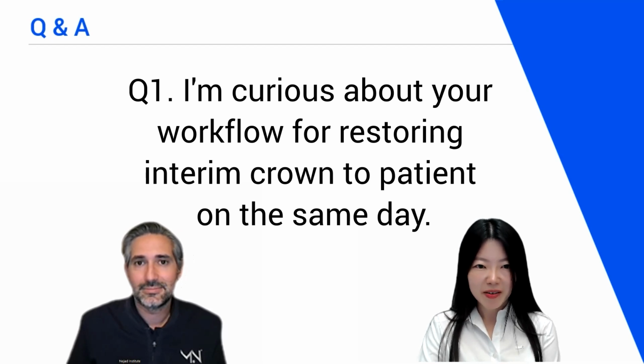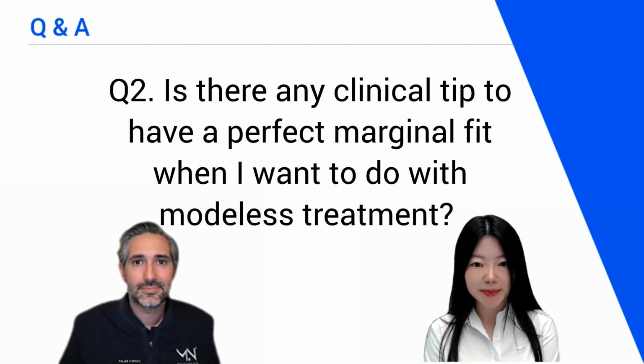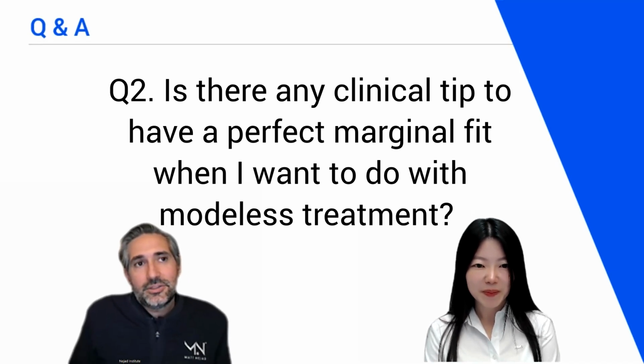Okay, thank you. Question number 2. Is there any clinical tip to have a perfect marginal fit when I want to do model-less treatment? A perfect marginal fit when you're doing model-less treatment. That's a good question. So I assume we're talking about 3D printing.